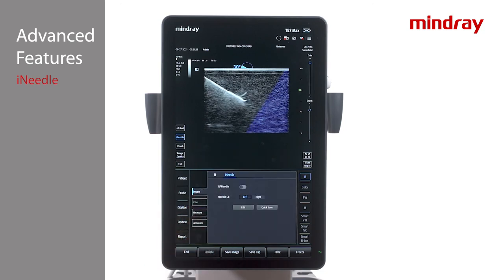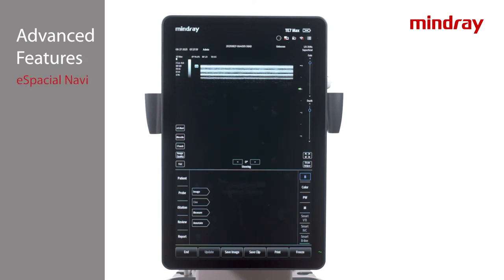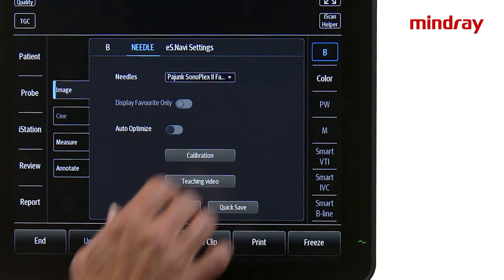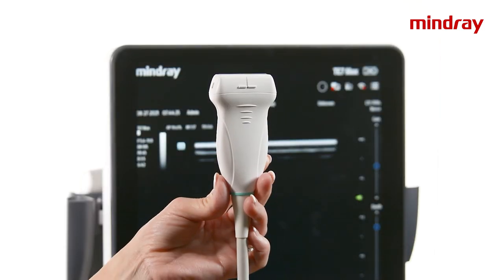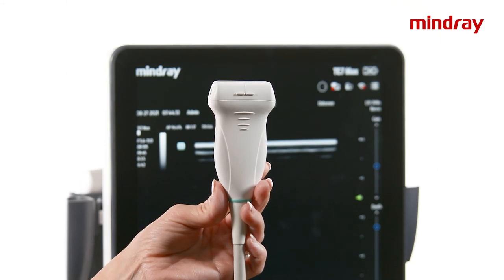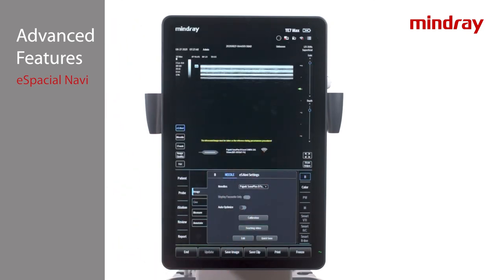iNeedle controls can be adjusted in the bottom middle image tab. To use eSpatial Navi, initiate the L11-3 VNS or L12-3 VNS transducer in the preferred exam mode, then press the eSpatial Navi tab on the left of the monitor to activate. Verify the needle being used is from the approved list in the Image tab. Press the Calibration button with the transducer approximately 12 inches from the system at the same level as the top of the TE7 monitor. Recalibration should only need to be performed once each day or if a different needle is chosen from the list.